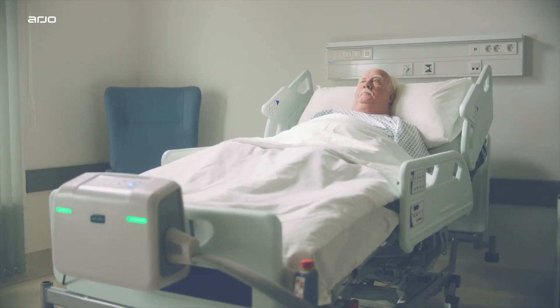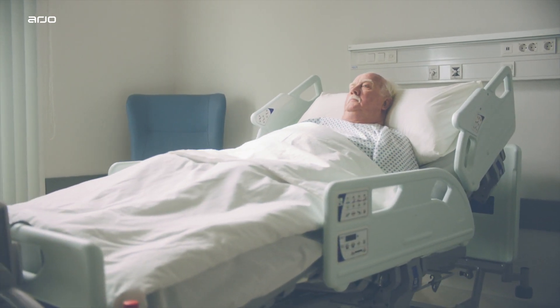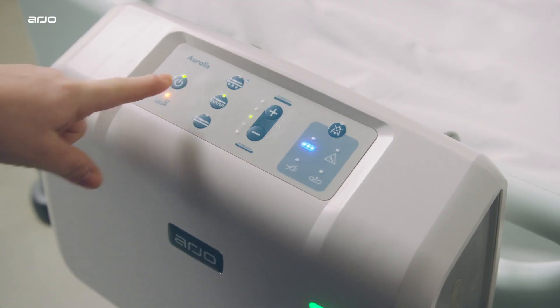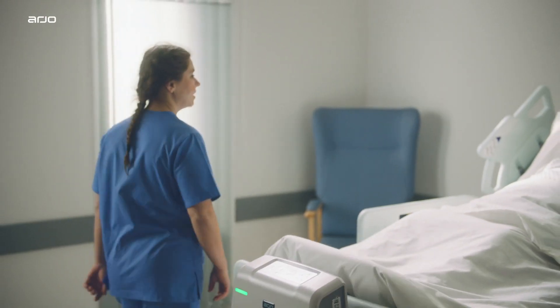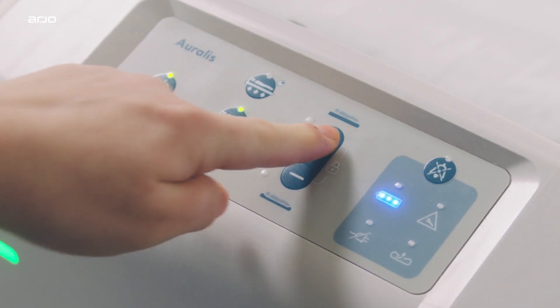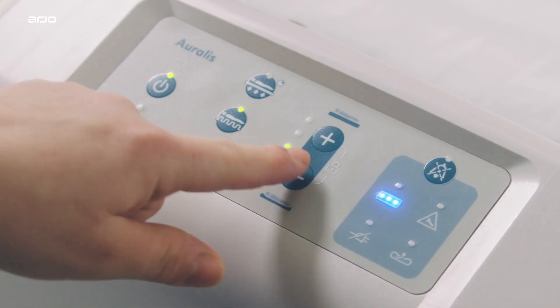Comfort control on the Oralis pump provides a softer or firmer support surface according to patient preference without compromising mattress performance. When the system is first switched on, the default is set to the middle comfort setting. The pressure and therefore comfort level can be adjusted through the control buttons. Simply press the plus button to increase pressure in the cells to make the mattress firmer, or press the minus button to reduce pressure to make the mattress softer.